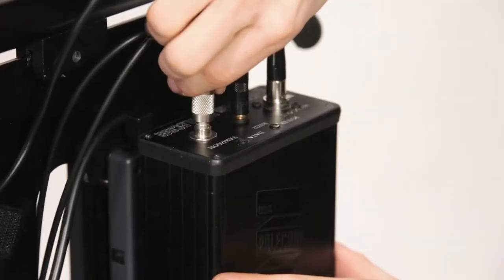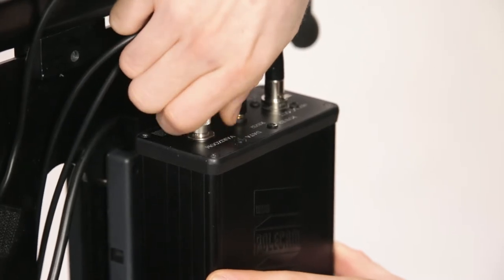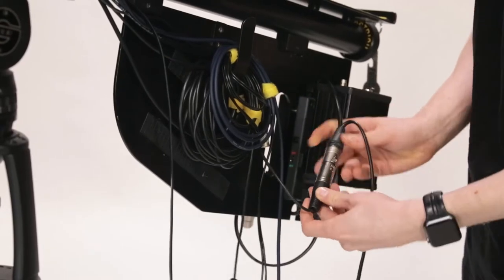Now take the VariZoom controller cable and connect this to the top of the interface unit. You can also now power the interface unit, the pole cam head, and the monitor as shown.